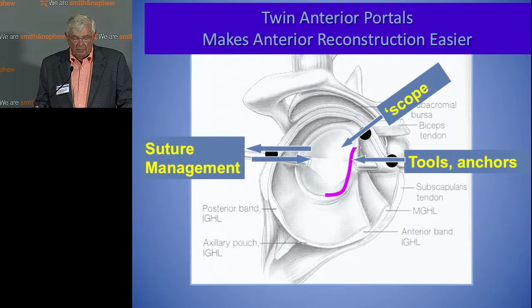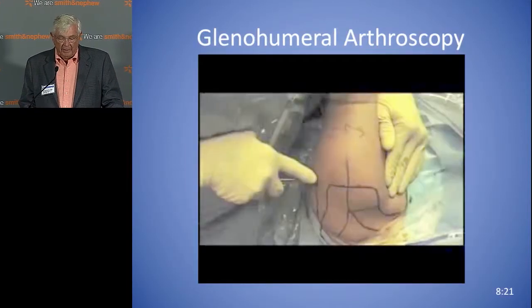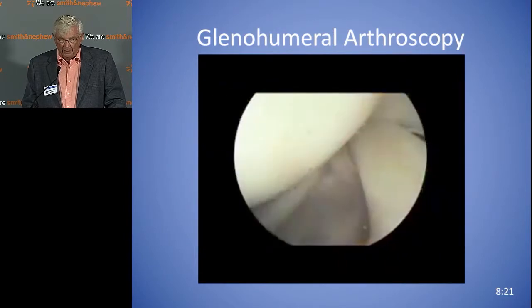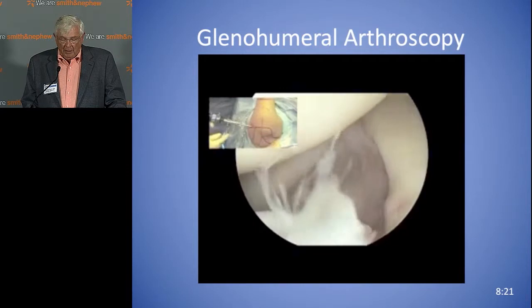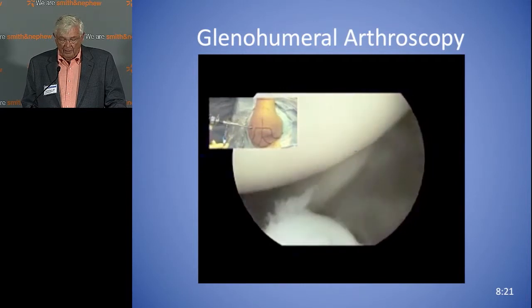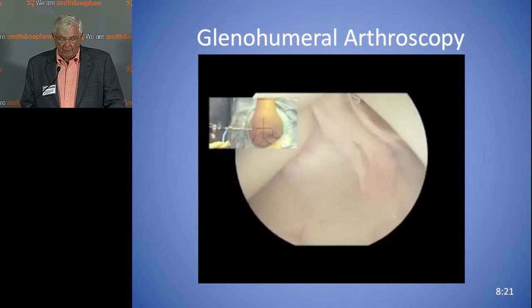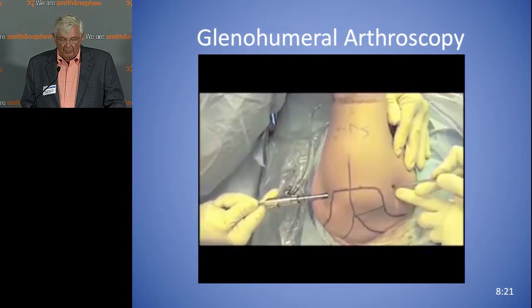I put this video with the scope posteriorly. This is Dr. Snyder's exam that we started doing in the late 80s — going through the joint in a systematic way. The idea is just to be systematic. Here the scope is coming in posteriorly. You can see the left shoulder. When you get in there, you can see the glenoid below, humeral head above, subscap, and then the biceps on your right. That's the triangle to see exactly where you're going to place your anterior portal.